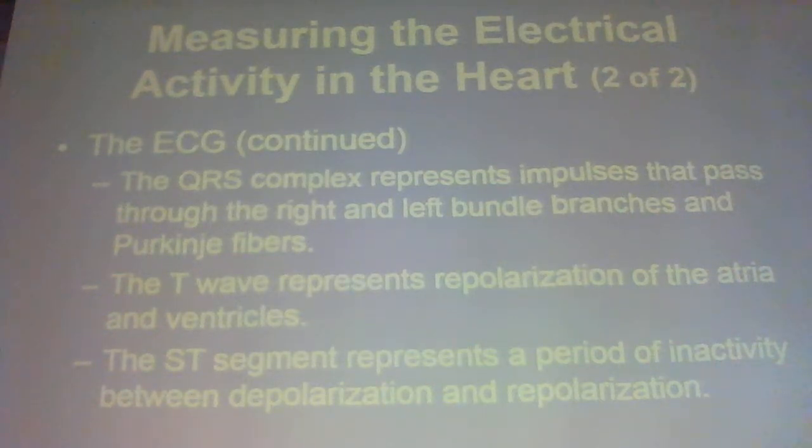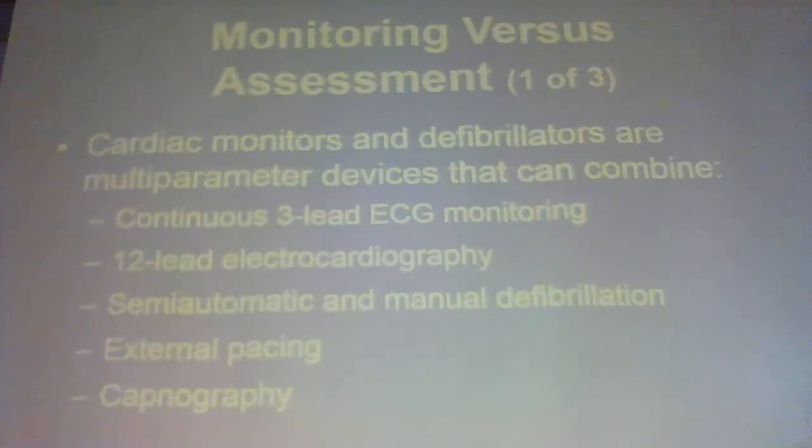All right. The ST segment represents a period of inactivity between depolarization and repolarization. The ST segment is the thing that we're going to be evaluating on our 12 lead to look for what? Elevation or depression, correct? And what is the beginning of the ST segment called? J point.